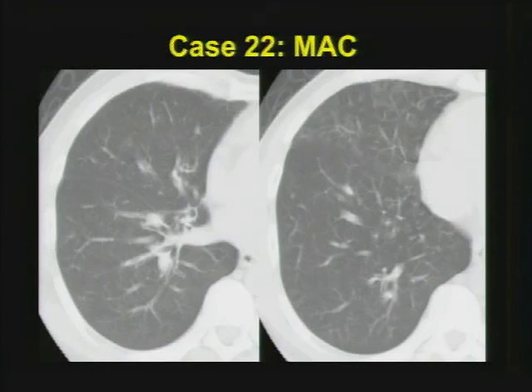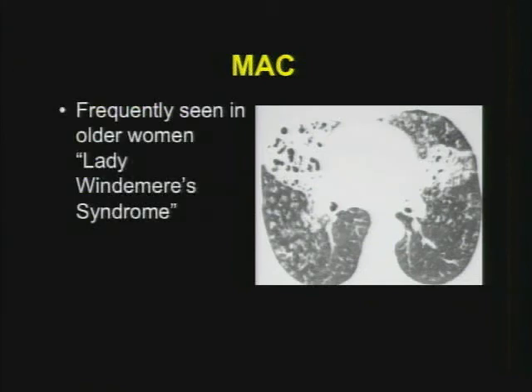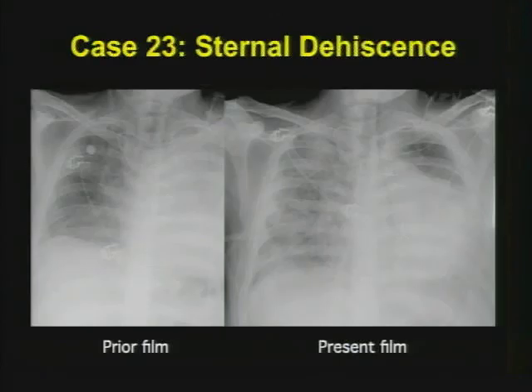Case number twenty-two — MAC: not the best example, but a reasonable example of endobronchial nodules. A better example of MAC shows lots of tree-in-bud type nodules with bronchiectasis in the middle lobe and lingula — classic clinical scenario: older patient, older women, the so-called Lady Windermere syndrome, with a chronic cough for months or years. Look for bronchiectasis and tree-in-bud classically in a middle lobe and lingular distribution — more common than typically appreciated.